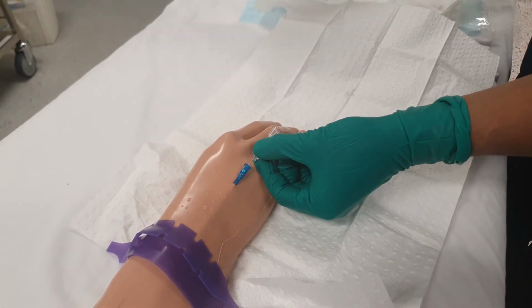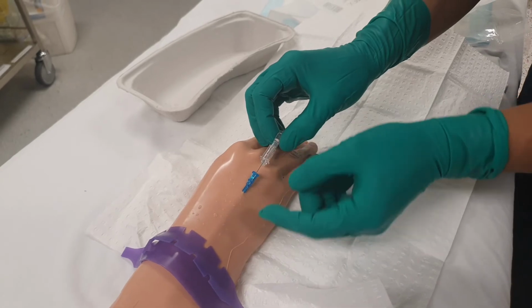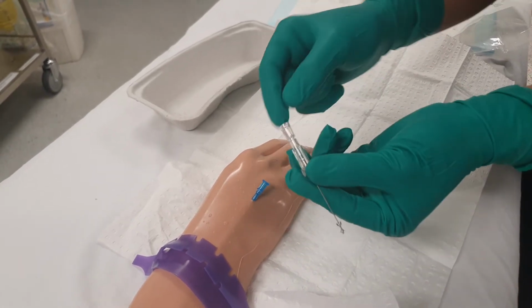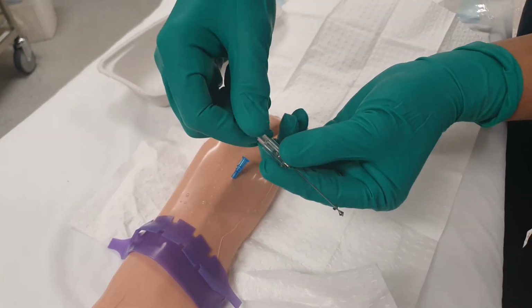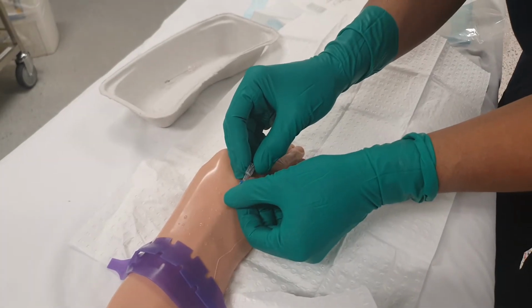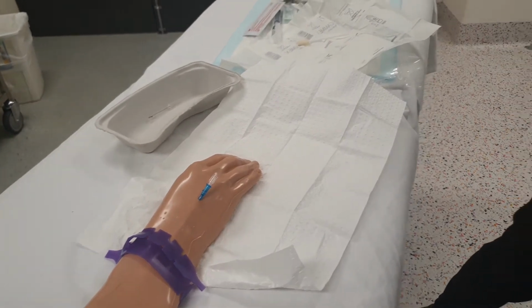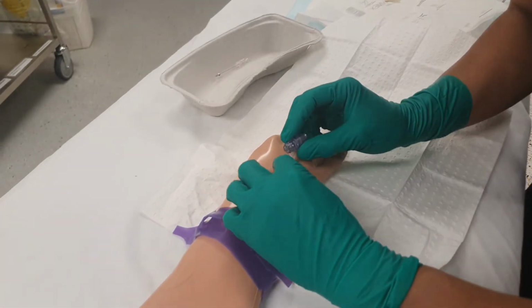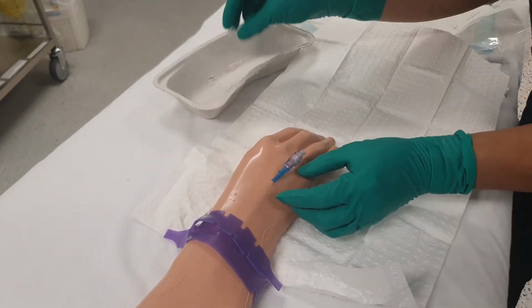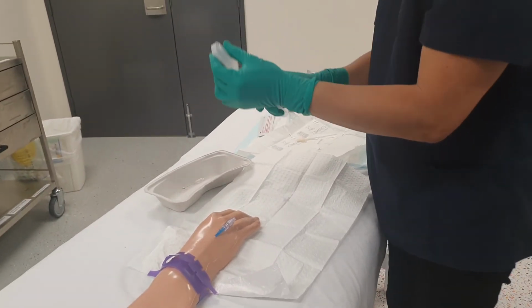So I've got my sharps container there. When you take this out, you can get a lot of blood that's flashing back. Okay, I don't know if you guys know this, but at the end of these cannulas, there's a temporary cap that you can put on until you get your cannula cap ready. So my cannula cap's here. I'm going to take my cannula cap, screw that in. I rarely use that actually, but I just wanted to show you that that's what it's for. It's probably one of those things that you didn't know.